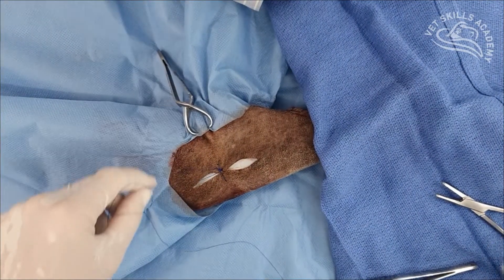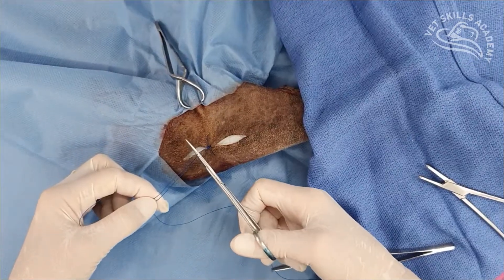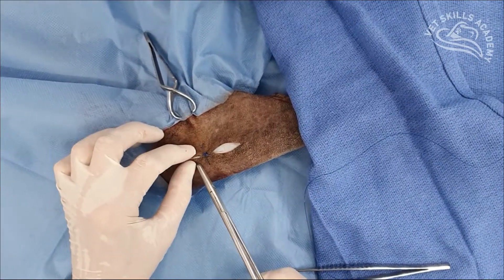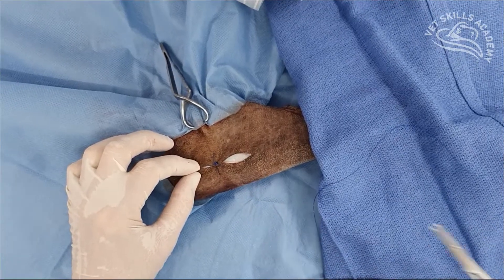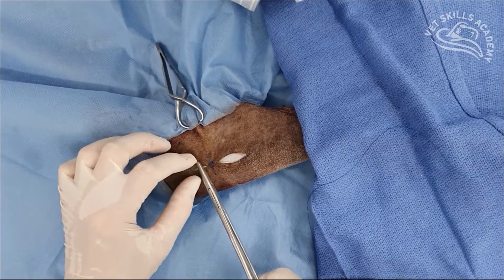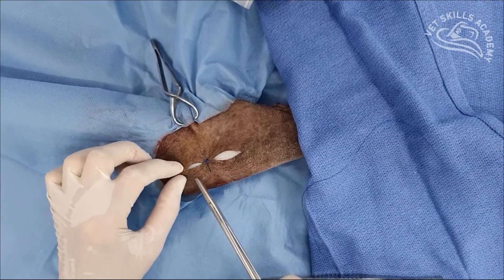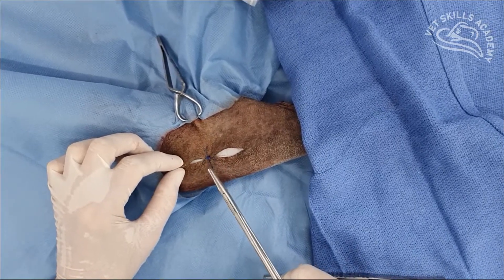So that's a near-far, far-near tension-relieving suture. We would then repeat anywhere else where we felt we needed to take a bit of tension off — we might come here and do another one there. And then we would intersperse with just simple interrupted sutures to create nice apposition along the whole length of the incision. You would find at the more tapered ends where there's very little tension that you don't need to put these near-far, far-near sutures in.